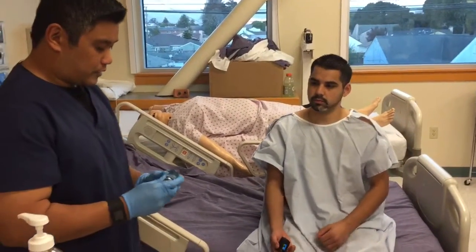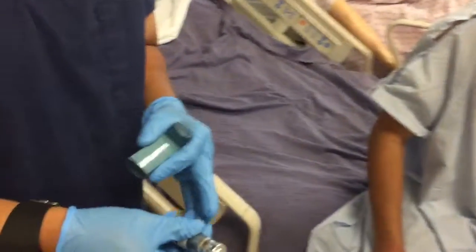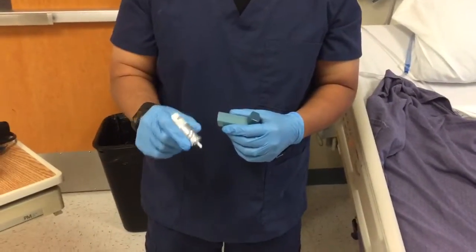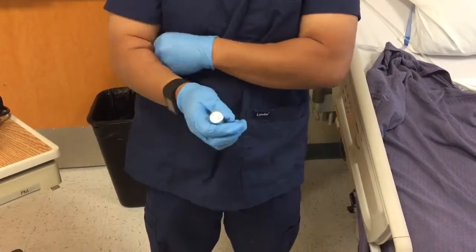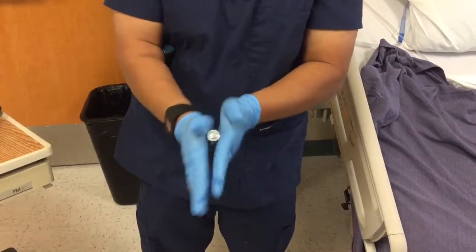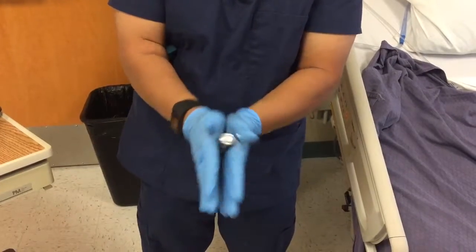So essentially how this works is we do have the canister, and within the canister is the propellant and the medication on the inside. Usually when it's first being used or been sitting around for a while, it's cold and needs to be warmed up. So typically you take it between your hands and just rub it, bring the temperature up a little bit, and wake up the medication within.